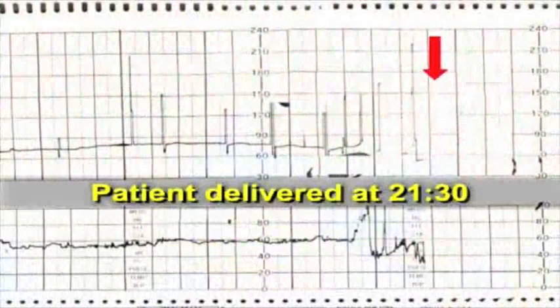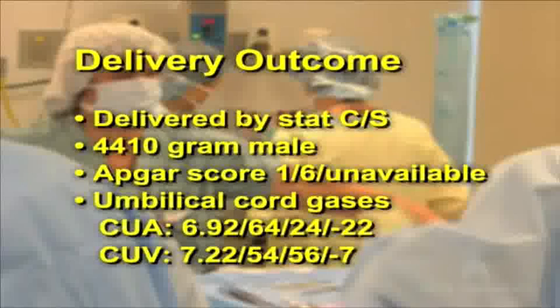At 2130, delivery is accomplished, 22 minutes after the onset of the fetal bradycardia. A 4410 gram male with Apgar scores of 1 and 6 is delivered by stat C-section with a cord umbilical artery gas of 6.92, 64, 24, and minus 22, and a cord umbilical venous gas of 7.22, 54, 56, and minus 7.